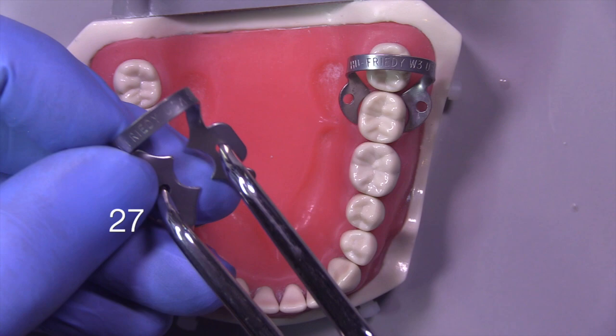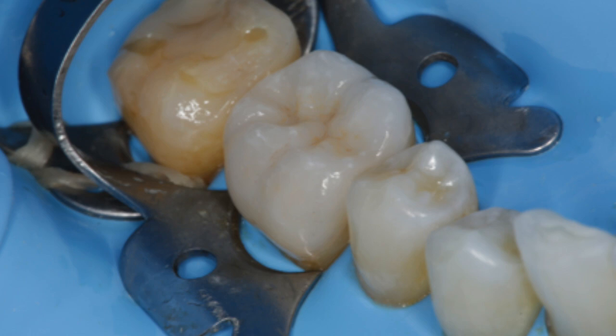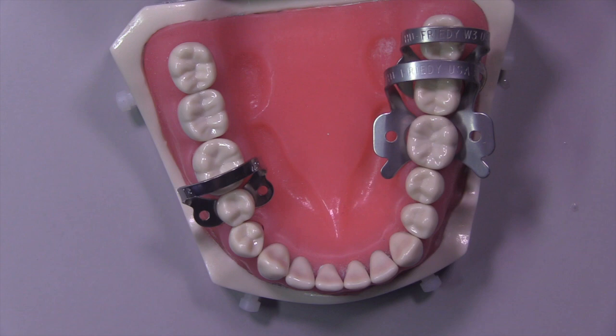Here's a 27 clamp and we're going to be placing that on the first molar. You can see how you can piggyback the clamps — piggybacking simply means you can put one clamp next to another clamp and they fit perfectly. That second clamp will retract the rubber dam further and allow you to gain significant access to the operation field.